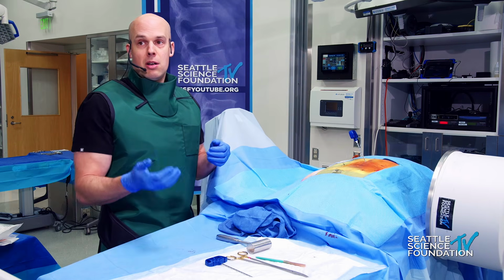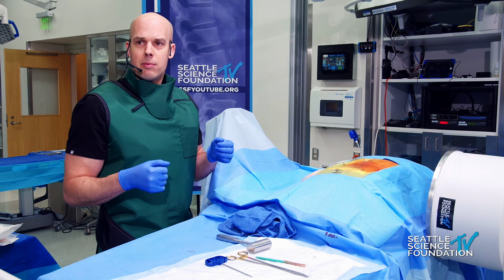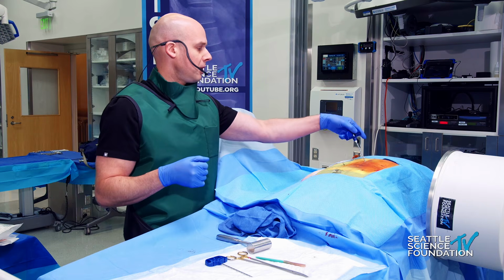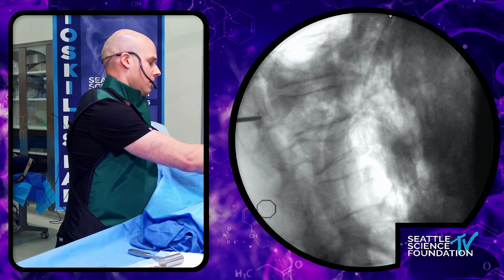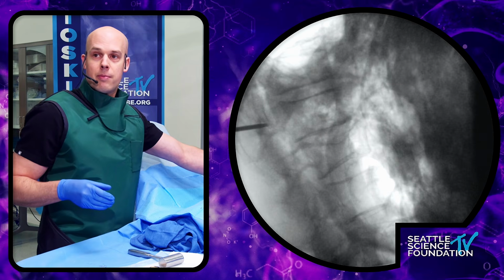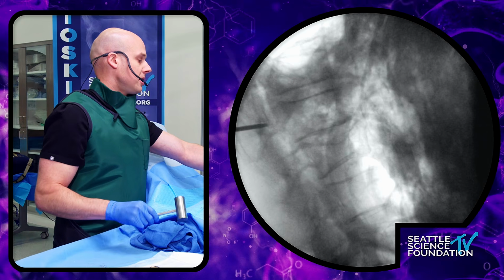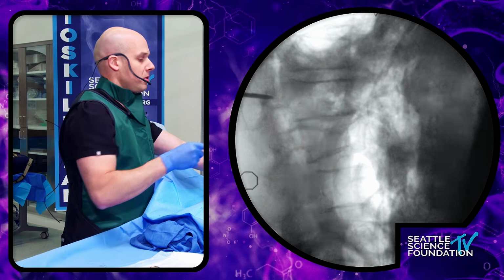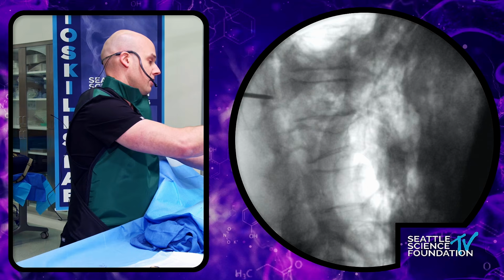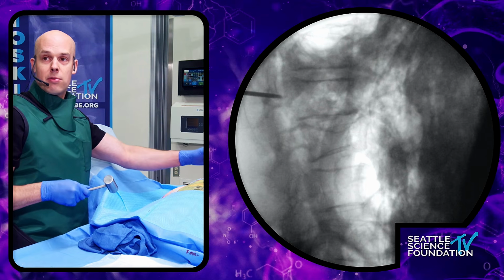So if we are too posterior, perfect. So we can flip it and redirect as needed. Okay. So what I did, basically, I flipped the bevel 180 degrees, and we should be getting very close.